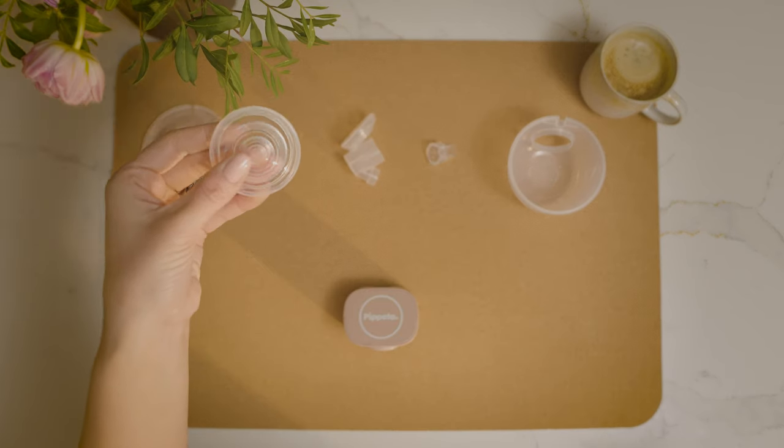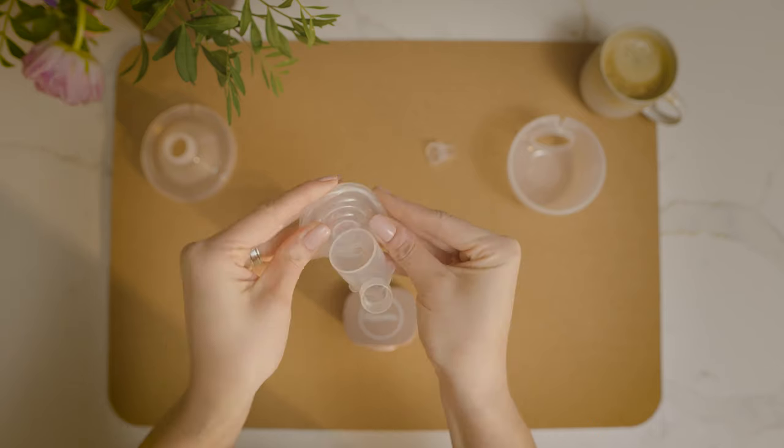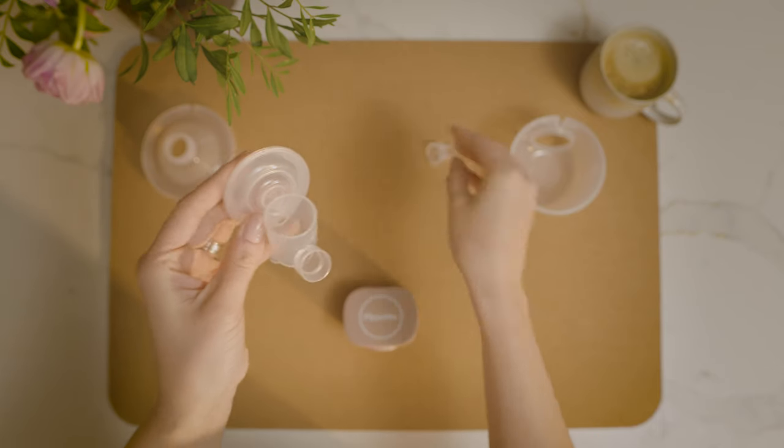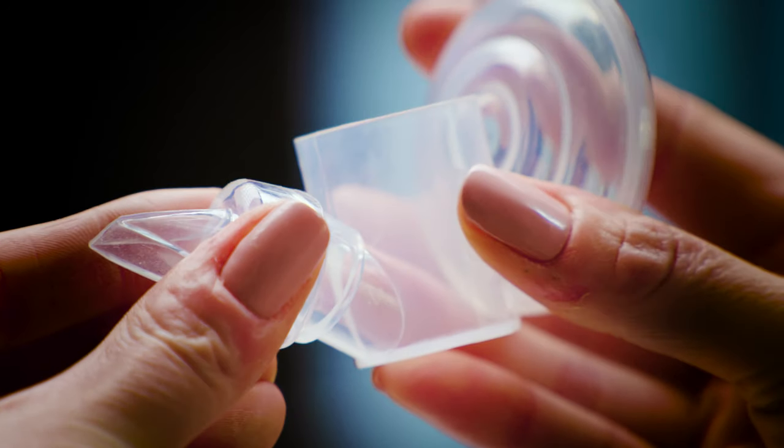Firstly, firmly attach the diaphragm onto the linker. Once together, attach the valve by matching the arrows.